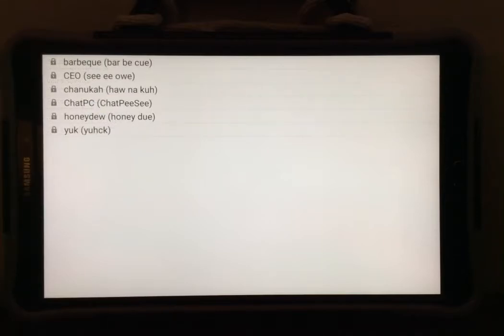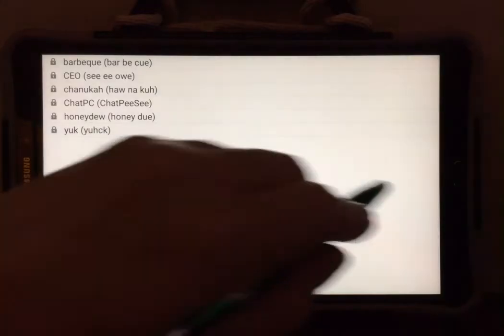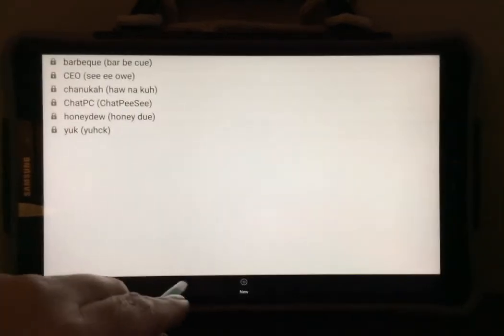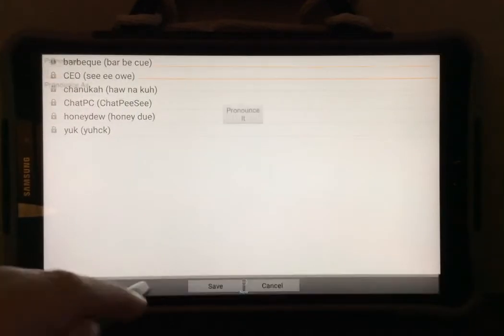You will see here there's already some pronunciation exceptions that have been added to the device. We can add our own. To do this, select menu, select new.